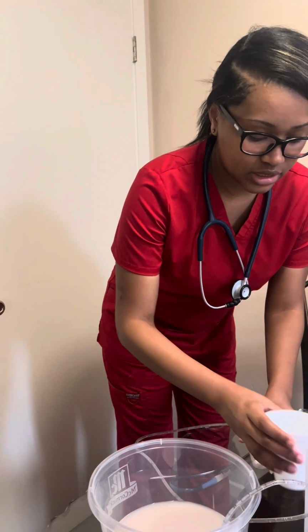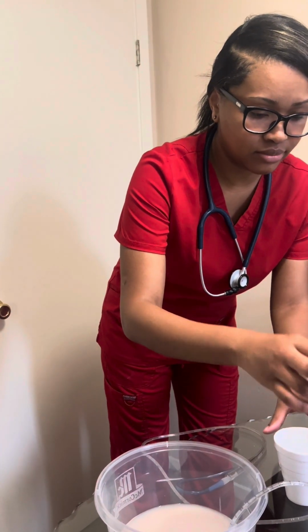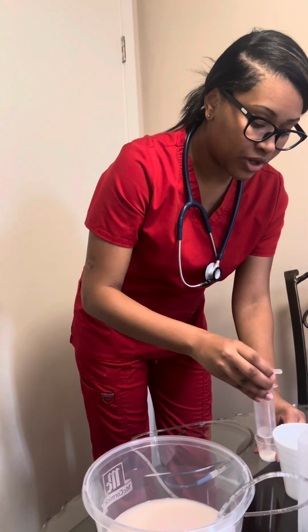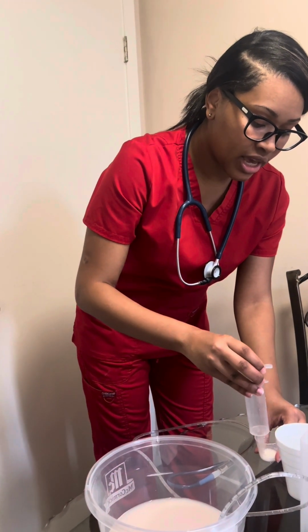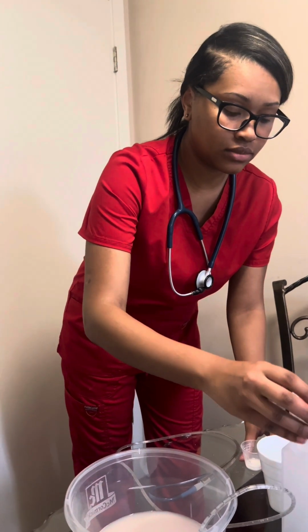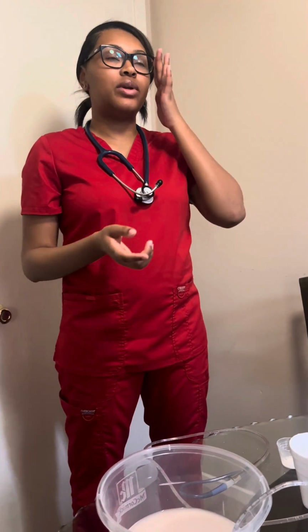And I would mix it with a little water. And if I was using more than one medication, I would have to put it in a different medicine cup. And then I would gather my supplies, and when I come in the room, I wash my hands, put on gloves. Hello, my name is Victoria.